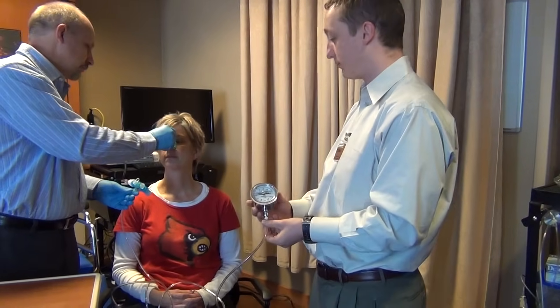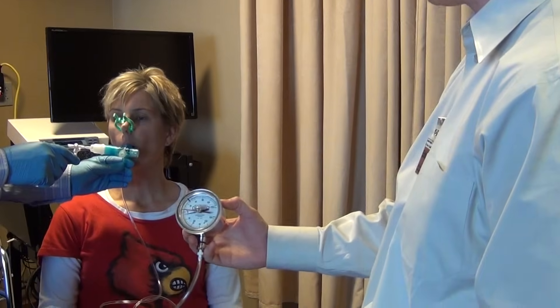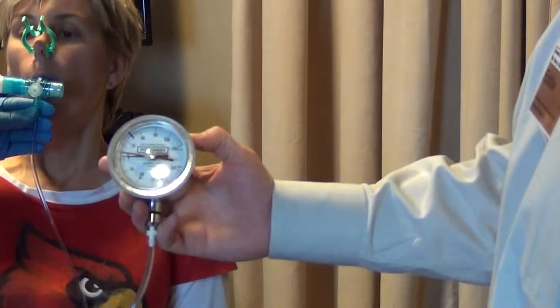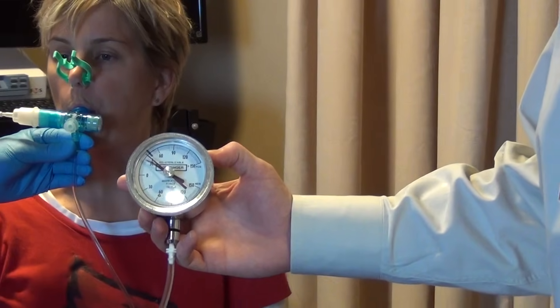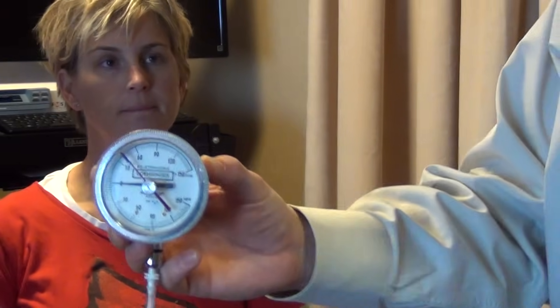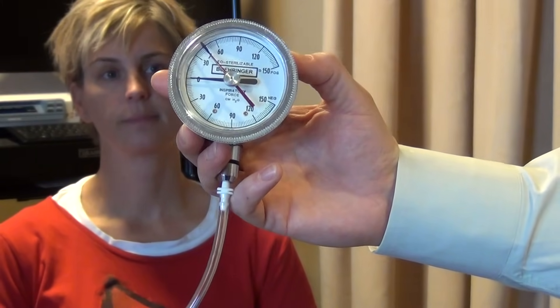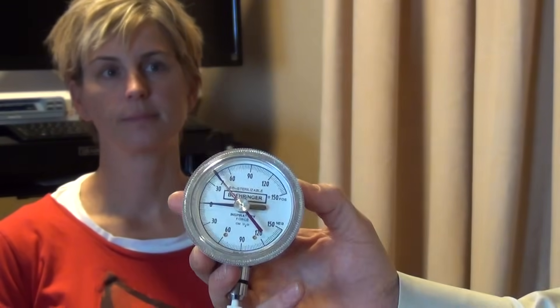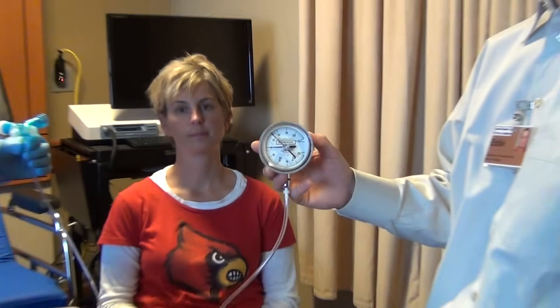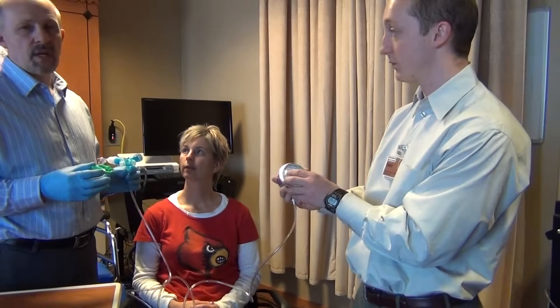We're going to put on the nose clip. Take one full chest of air in. Breathe in. Now blow it out. And stop. Now you can see the red reference arrow showing the peak amount of pressure in centimeters of water. We would repeat that test three times total.